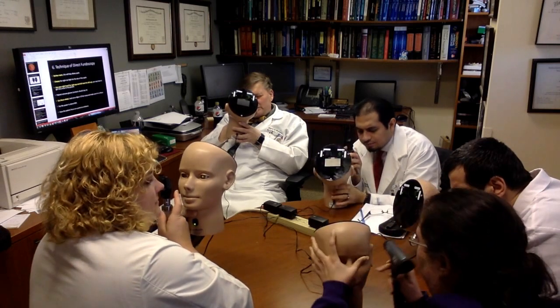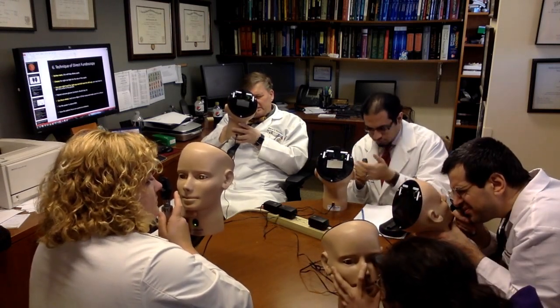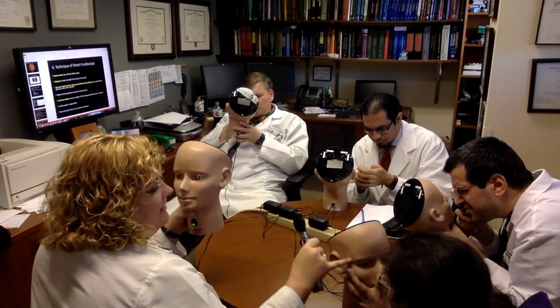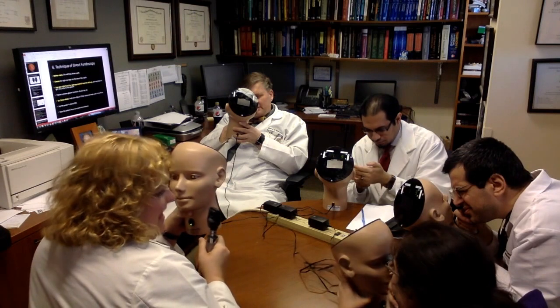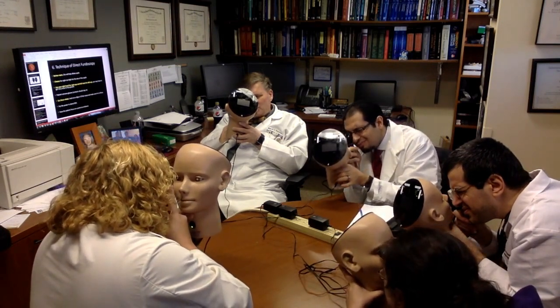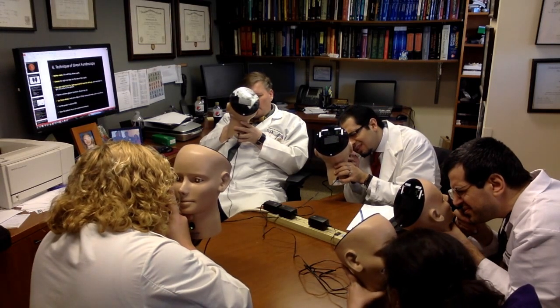Now, if everyone sees the disc, let's look at the disc. You'll notice it's kind of a circle, right? Do you agree? But if you actually look more closely, it's slightly an oval. It's slightly taller than it is wide. Does everyone agree? Yes. Okay.